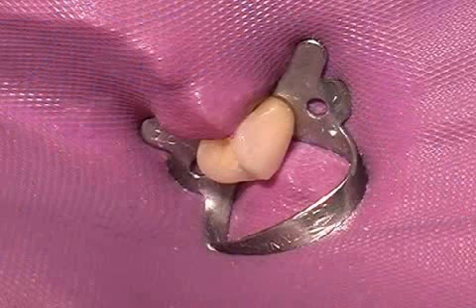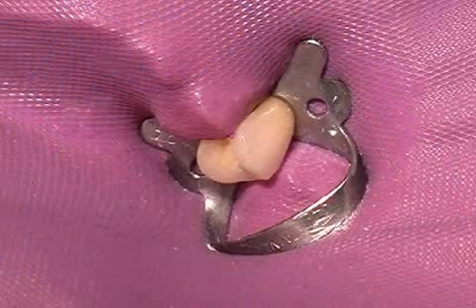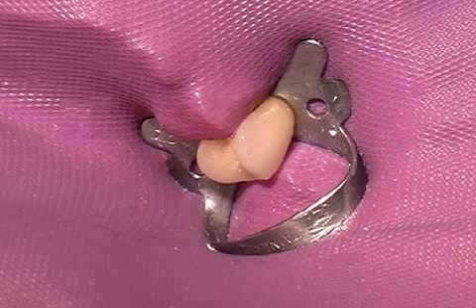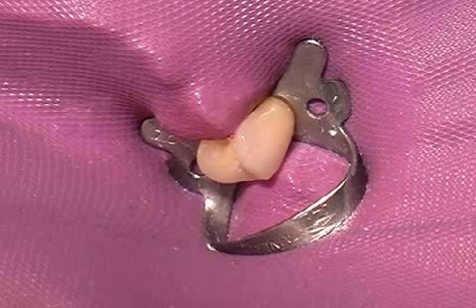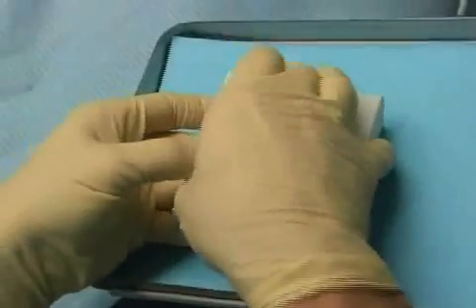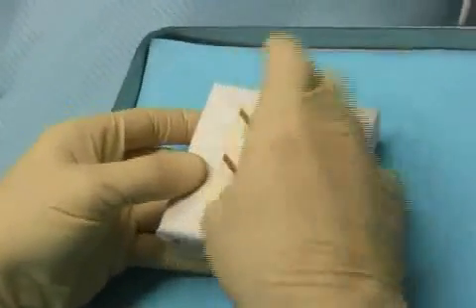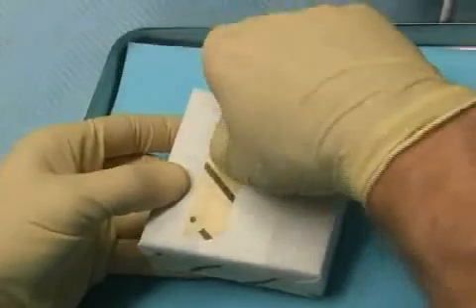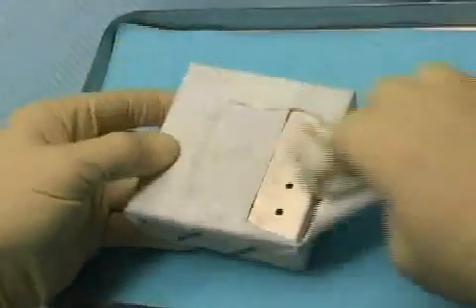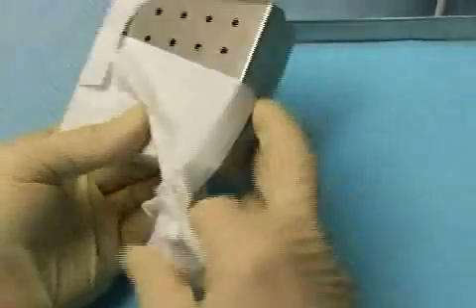Saliva contains many different bacteria that can endanger the success of a root canal treatment. Here you see a cofferdam insulating the tooth from the tongue, other teeth, saliva, and blood. Furthermore, it's very important to work with sterile instruments. Here you see a root canal treatment box wrapped to preserve its sterility, opened just prior to the root canal treatment.